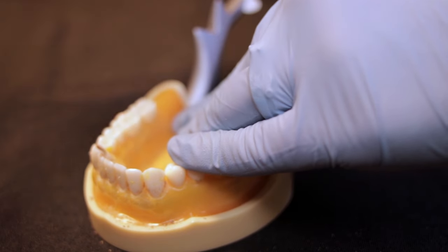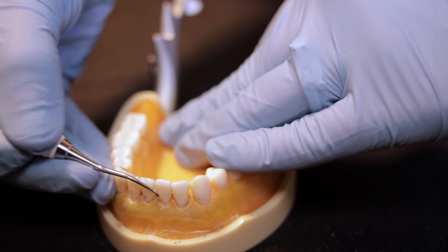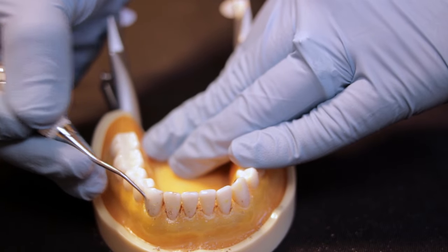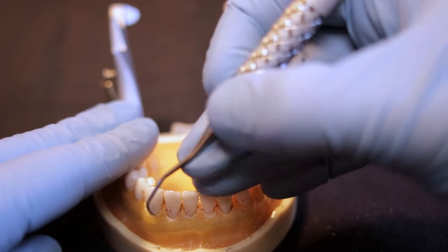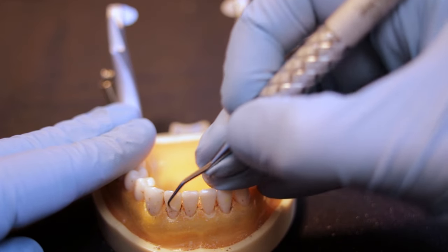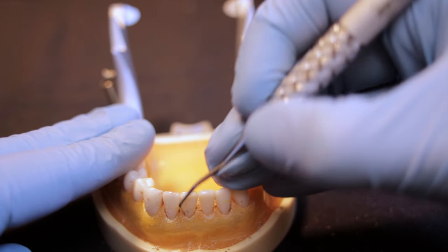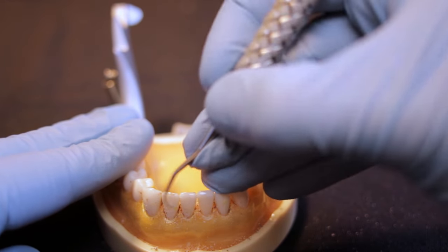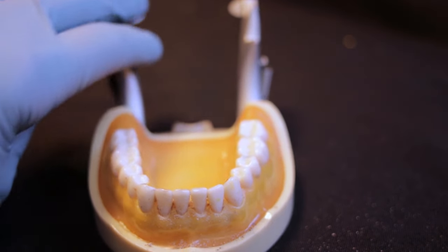Now I'm going to do some final touches on the straight facial — this is a more advanced technique where I have the toe down of the Gracie 1-2 and do a horizontal stroke across the tooth to pick up extra stain. Then coming from the other side, cleaning up that remaining stain. You'll be using vertical strokes, horizontal strokes, and oblique strokes — all of these are going to be necessary to get stain fully off the teeth.